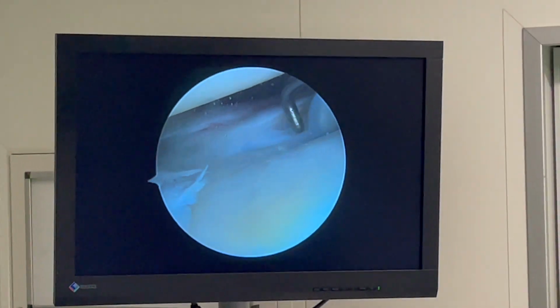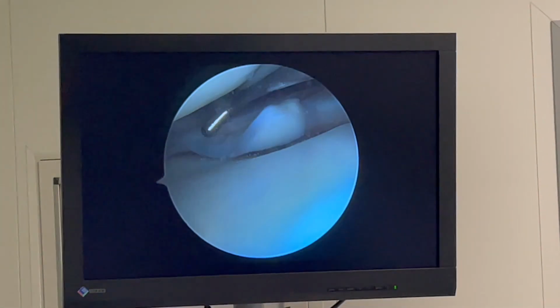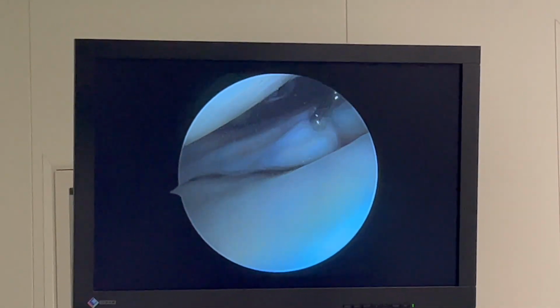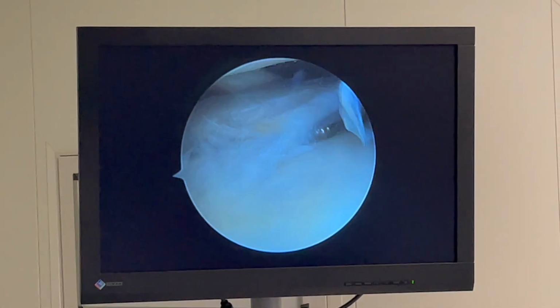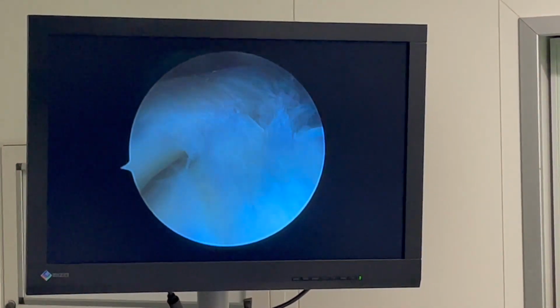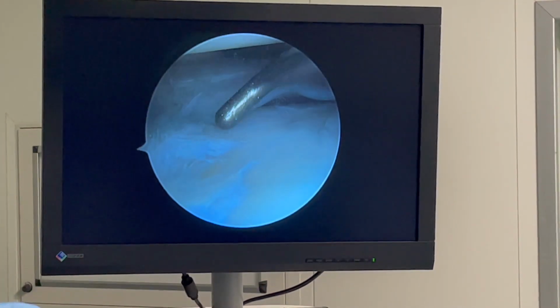So that is how the menisci are. Then we can just take this part off, which is not going to affect you at all, right? And this has been there for 7 months now? Yeah. So now this one is not going to do well, even if you try to repair it, because it has very less blood supply, and which is called the white part. So we are going to trim it off, right?